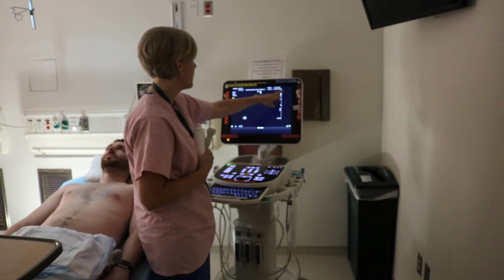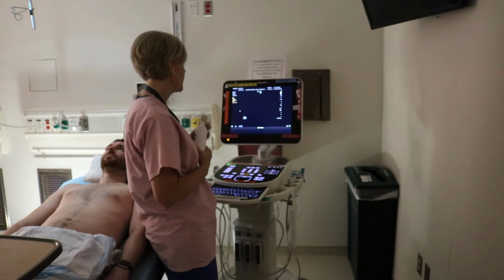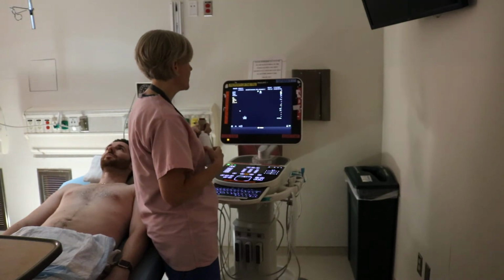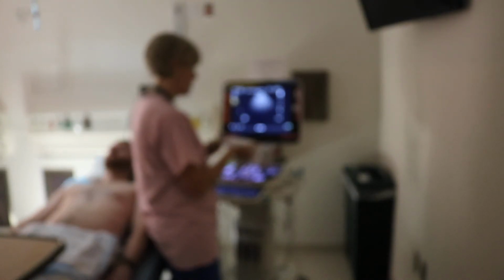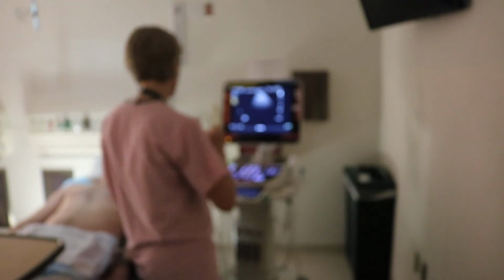I know we're in abdominal presets because it says fast and because the cursor is on the left side of the patient's imaging. Make sure you're in the correct presets also whenever you start imaging. So we're going to start with the left upper quadrant. Sorry, we're going to start with the right upper quadrant.